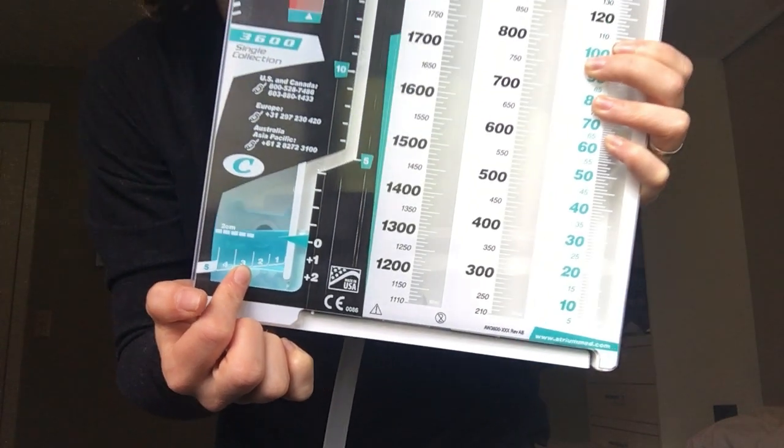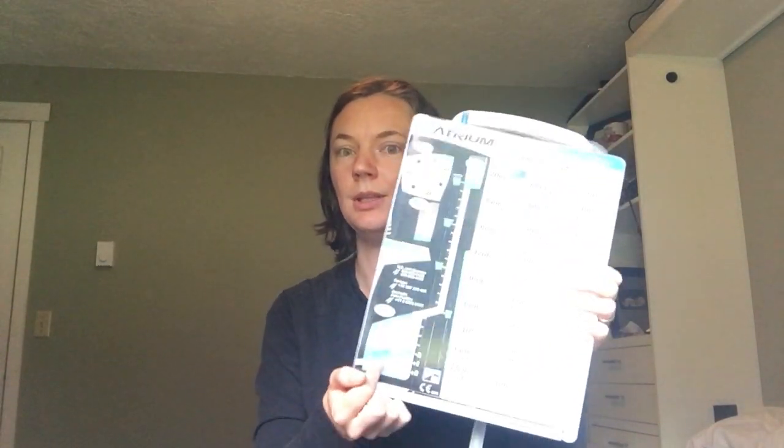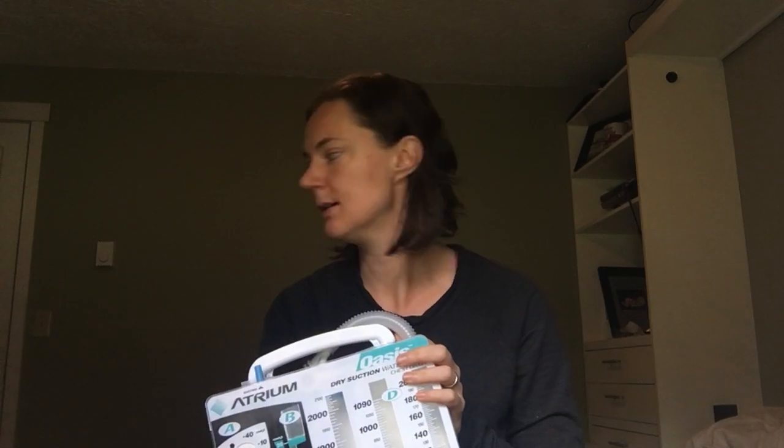Any air leak is a sign that the lung is not staying fully inflated, and that the chest tube is not ready to come out yet. Like I mentioned before, if your patient has that for several days and it's not improving, they might get something like a Heimlich discharge instead of going home with the chest tube. Usually when patients ask when this will come out, if they're having an air leak, we say this has to get better, and it has to not bubble in here when you cough for it to come out. You can also redirect those questions back to the doctors.